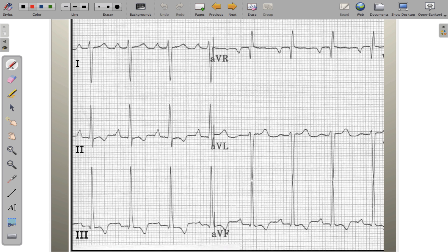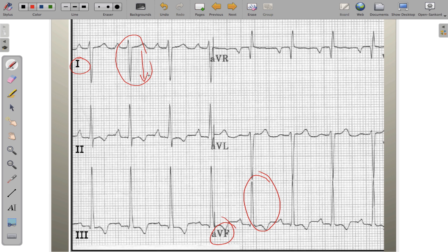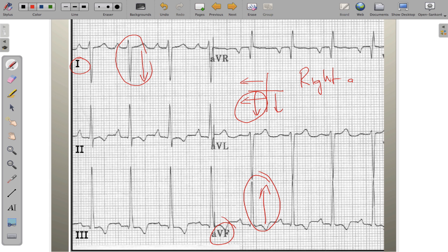In the third example, lead 1 is negatively oriented and lead AVF is positively oriented. A negative lead 1 means traveling toward the right arm; a positive AVF means traveling toward the feet. The overlap is in the right-axis deviation quadrant — between 90° and 180°.